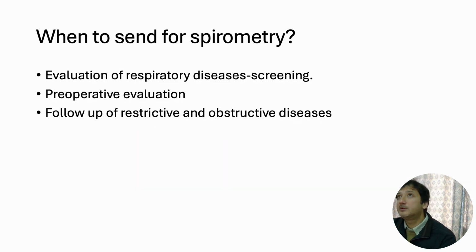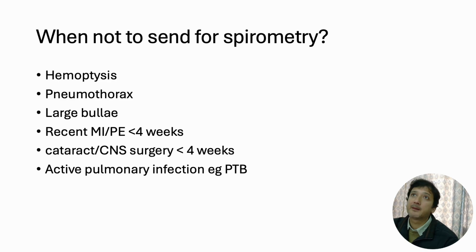So when should we send a patient for spirometry? It is used by pulmonologists for the evaluation of respiratory diseases like screening. We also use it for pre-operative evaluation to test the lung function. And after the treatment, how the patient is doing, how the treatment is going on, its effects, we can follow up also by spirometry.